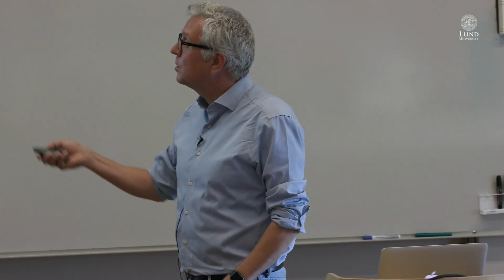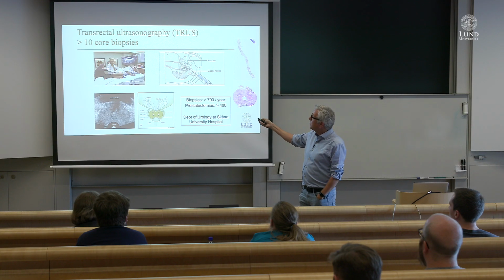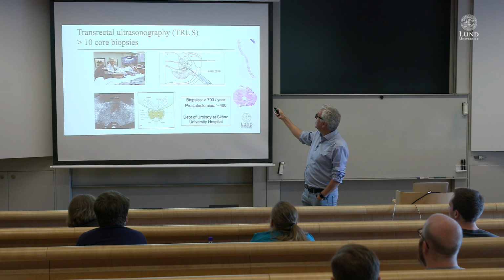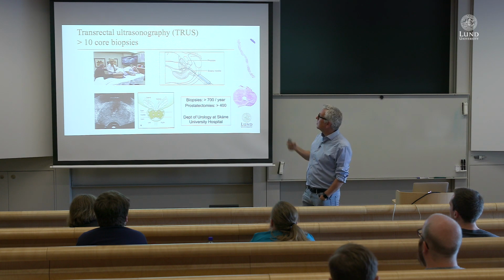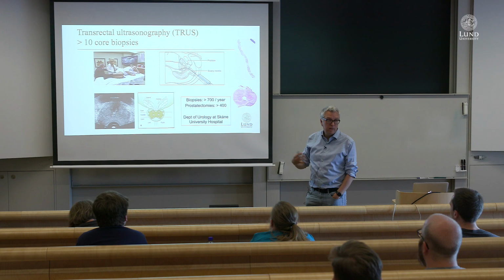But there are two types of examinations that the pathologists do. One is that they inject a small biopsy needle and you take out a small slice of the prostate. And then you fixate it and you stain it and you take images of it. But sometimes you actually take out the whole prostate, and you might do the same thing.